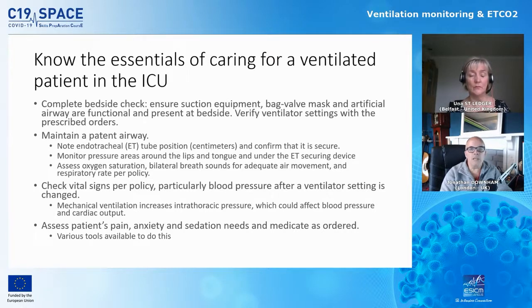You're also going to be checking the ventilator settings. Now, commonly in the UK, what we do is discuss those ventilator settings with the person handing over to us, what they were, and then you will ensure that they remain the same as what was handed over to you. Those ventilator settings might change during the day, depending on what the medical team want to do with the patient or how the patient is responding to treatment. So you need to be sure that the ventilator settings are as they should be.